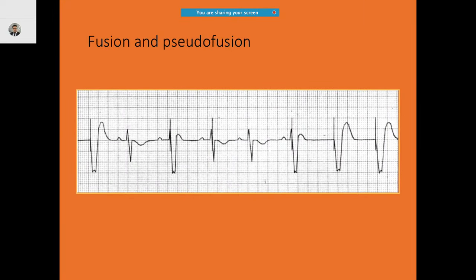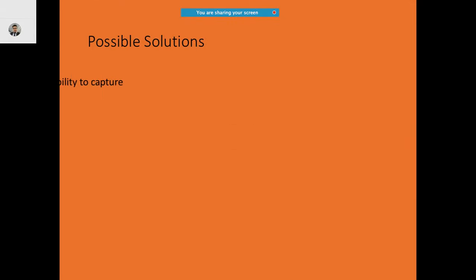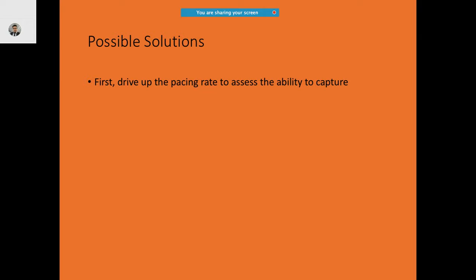Pseudo-fusion occurs when the pacing impulse falls within an intrinsic beat, and the intrinsic beat is not altered at all — the pacing impulse is ineffective. In the ECG strip, the narrow QRS is the inherent morphology. The pacing spike falls during the QRS but doesn't change it — that is pseudo-fusion. The fusion beat shows different morphologies that are a mix of the inherent and paced beat, such as a wide QRS.